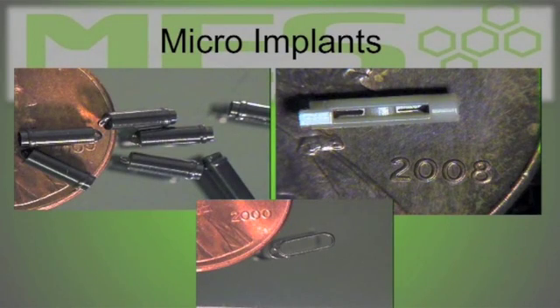These are some other PEEK implants. Some of these are machined, and again, some of these are actually making a machined mold and then molding the parts around that. So the features in the upper right hand side on the tan part, those thin sections in between to hold a suture, to anchor a suture in place, is 2.5 thousandths of an inch in width.